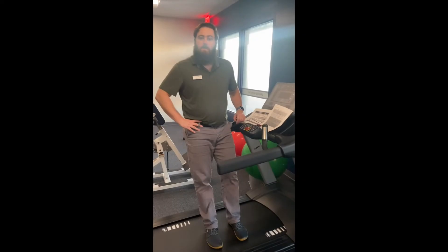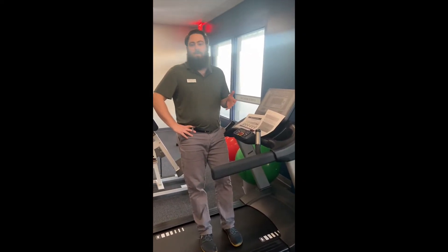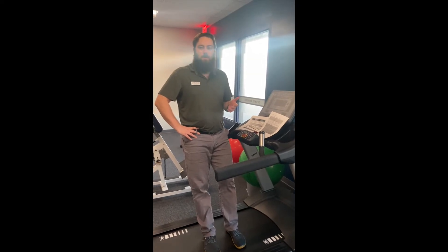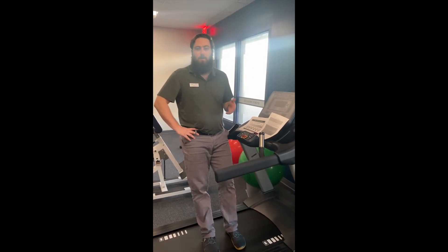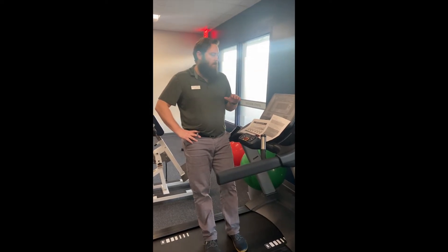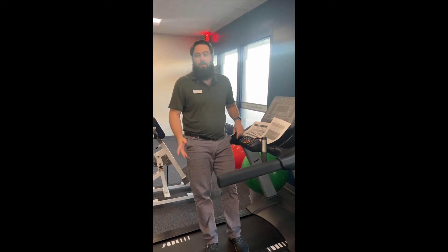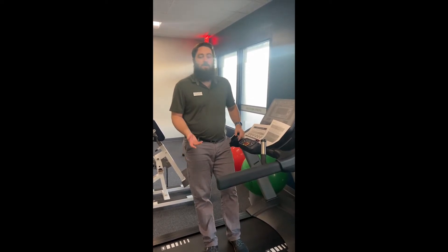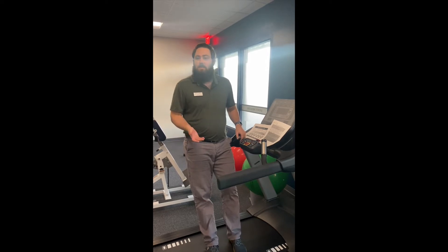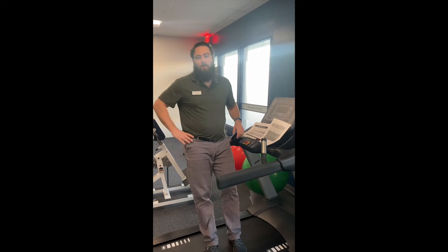After two minutes are up, you can head over to the treadmill. Set up the treadmill for your patient — the speed is determined by the patient's height. For patients up to 5'10", the speed will be 3.2 miles an hour; for patients 5'10" and over, it'll be 3.5 miles an hour. It'll start at 0% incline, then every minute it'll increase by 1% while the speed remains constant. If the patient is able to get all the way up to 15% incline, instead of increasing the incline every minute, you will increase the speed by 0.4 miles an hour every minute.